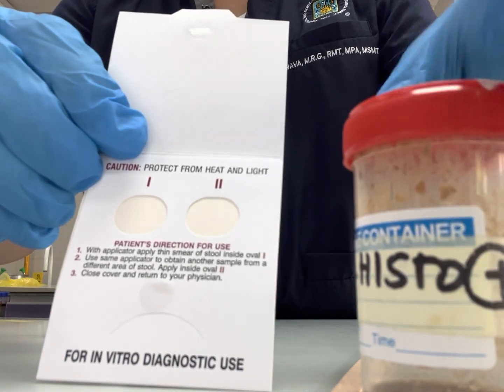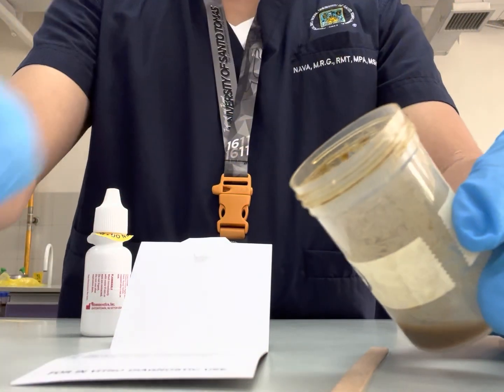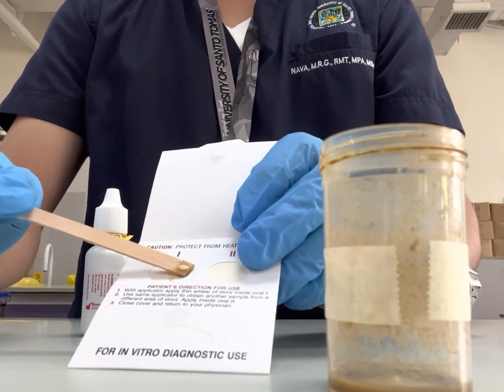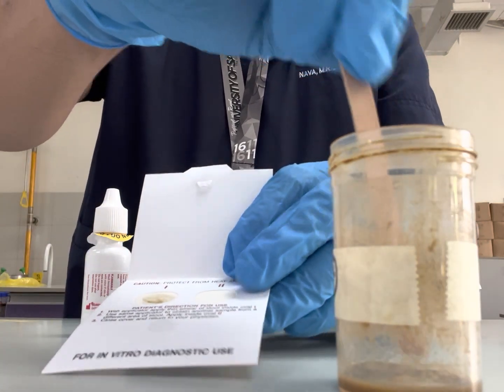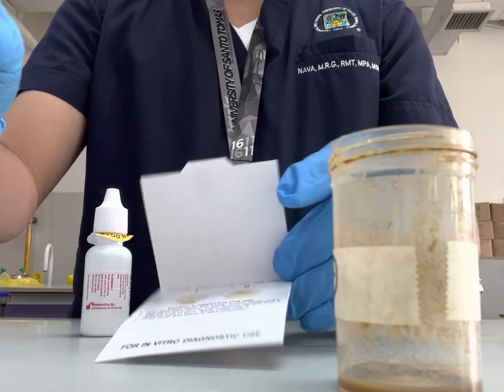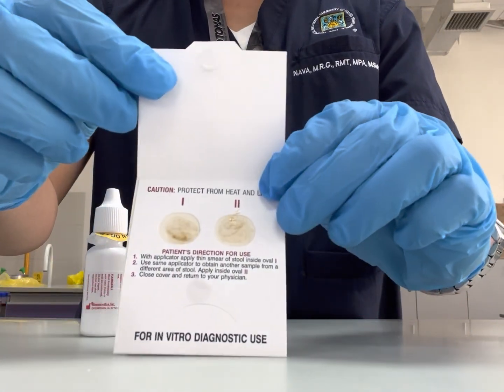To demonstrate a positive reaction for this video, we will be using a positive patient sample. Using an applicator stick, smear the stool sample on the filter paper area. Repeat using the same stool sample on the second filter paper area. Properly dispose of the applicator stick, cover the sample container, and cover the sampling area.